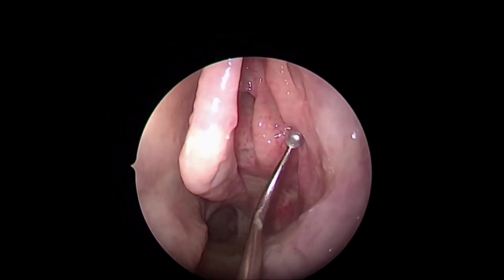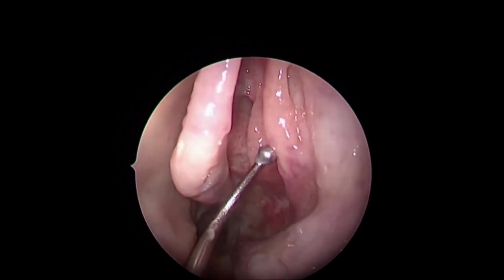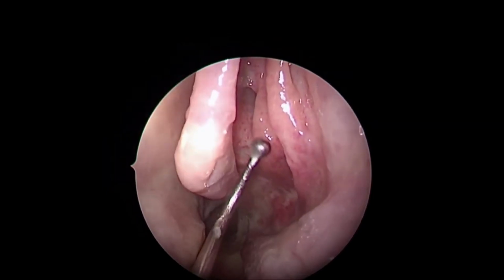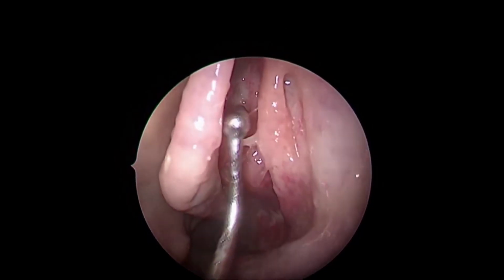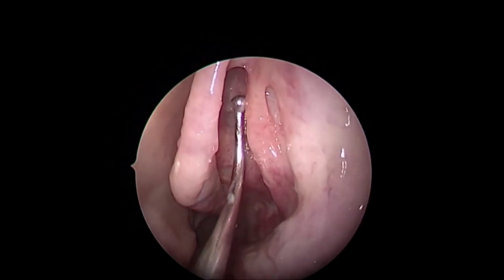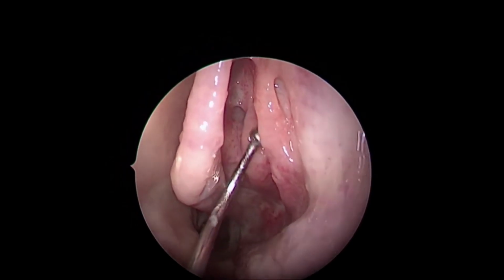Now, this is the uncinate process, which is generally considered to be the first step in sinus surgery. And as we all know, well begun is half done. So a good uncinectomy is always a very important step for the sinus surgeon to accomplish a good sinus surgery. Now, moving behind the uncinate is a narrow cleft. This is a two-dimensional cleft where I am insinuating my ball probe.